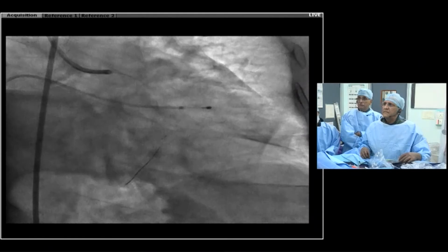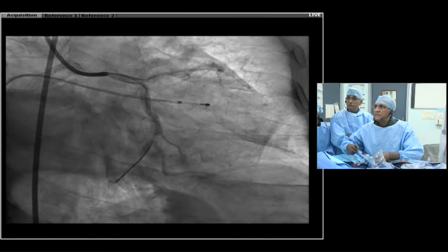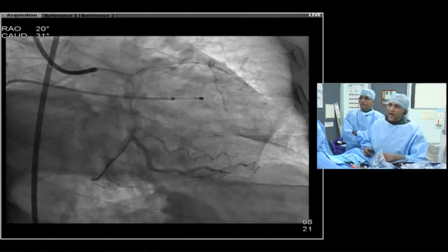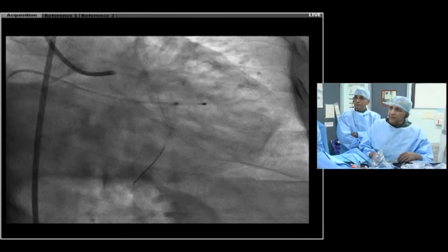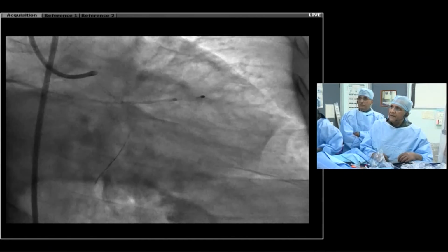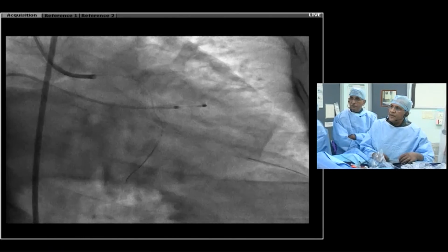What are the scenarios in which you prefer to go over to the regular rota? I think that larger branch? Yes, I am going to try that. I wanted to get my microcatheter distally and then reshape my wire a little bit. So this is what I do.